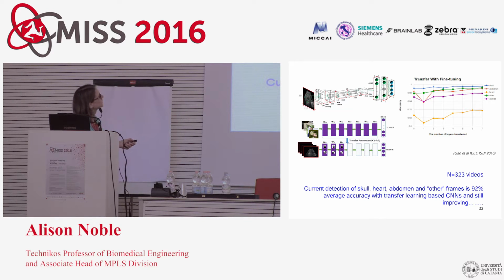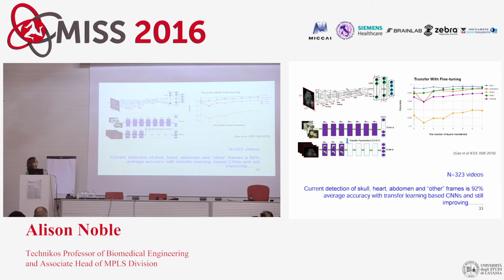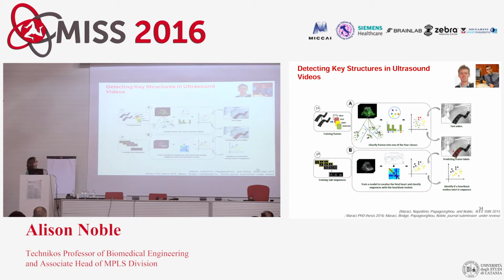Much better than for the heart, which is the challenge. The challenge for the heart is that it is very small, so you don't have many samples of it, and the sampling of it is not very accurate. And of course, hearts appear in abdomens, so there is an issue in how we define them, and those are the sorts of things that we've been working on most recently.